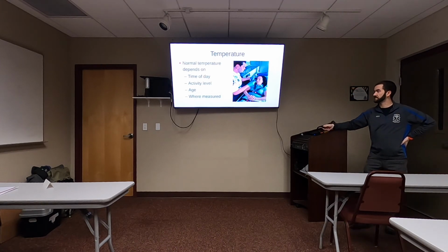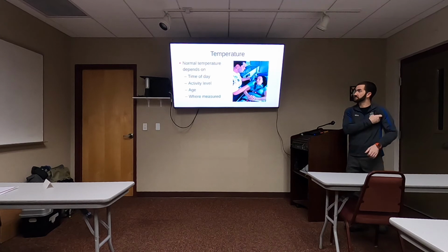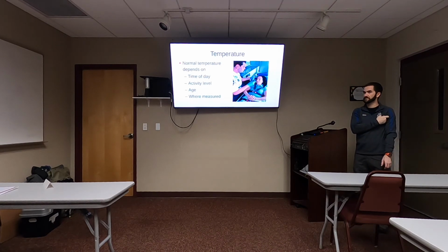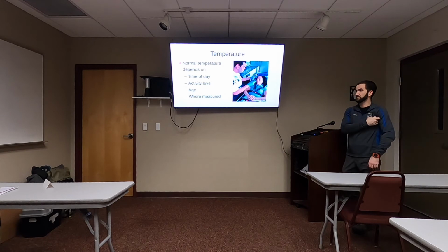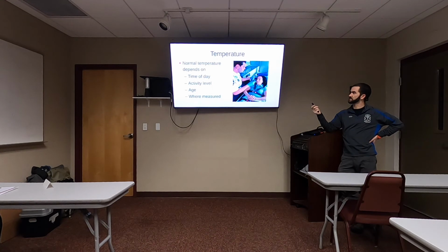And depending on where you measure it depends on what kind of reading you're going to get. So you've got to get an oral temperature in just about the right spot to get it to actually read what their normal core temperature is, pretty deep under their tongue. You can take temperatures mid-axillary. You're usually going to get a couple degrees lower reading there, but you can do it there, just stick it in an armpit. We're not going to go in for any other more intrusive bodily temperatures. We do use the little infrared gun thingies, and those do okay.